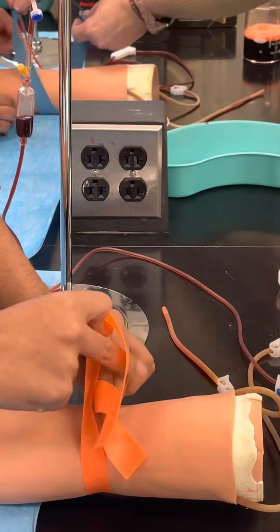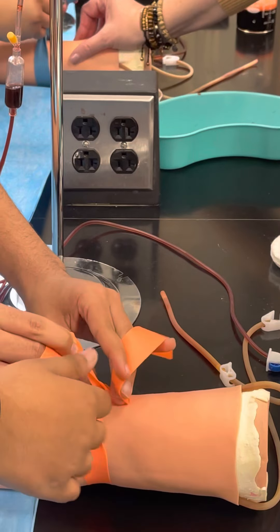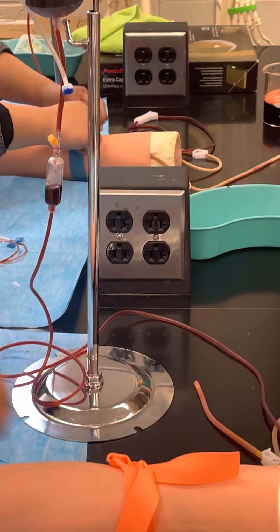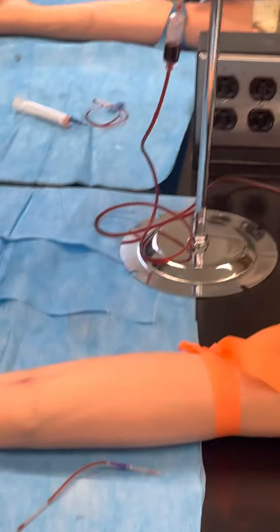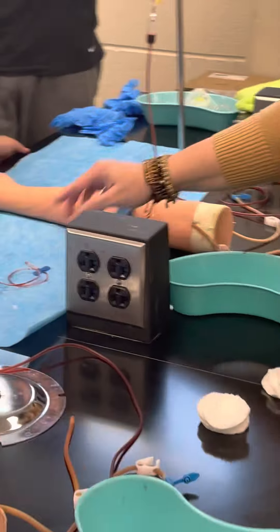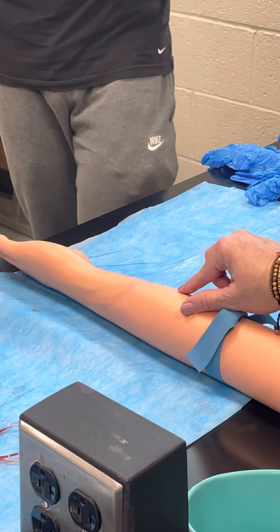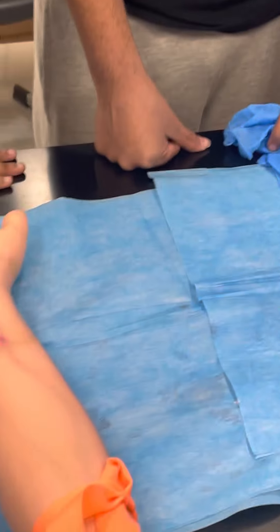The arms are anatomically correct in terms of where the vessels are placed. Just one of you draw blood at a time, but whoever is going to draw blood first, go ahead and palpate or feel for where you want to draw from. You can see some areas that have been used commonly — you can choose anywhere.